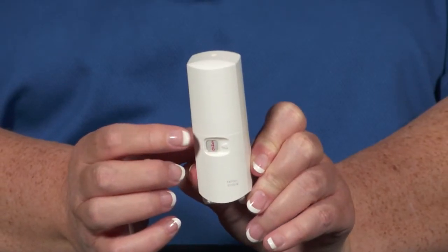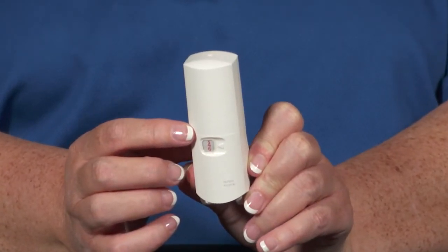The first thing I want you to do is to look here to see what number it's on. If the number is 0, it's out of medicine and you need to get another Respiclick. If the number is bigger than 0, then you're good to start.